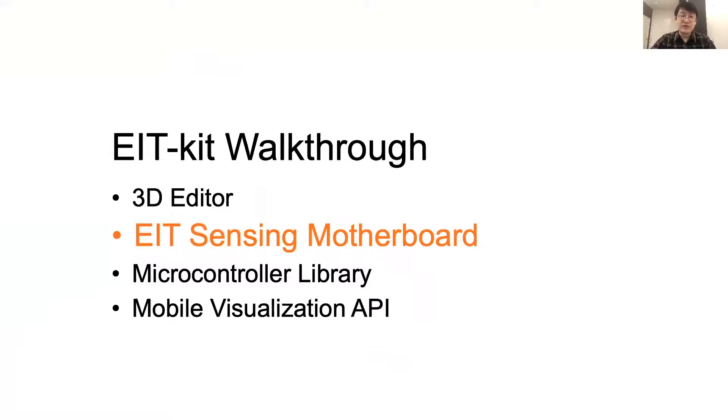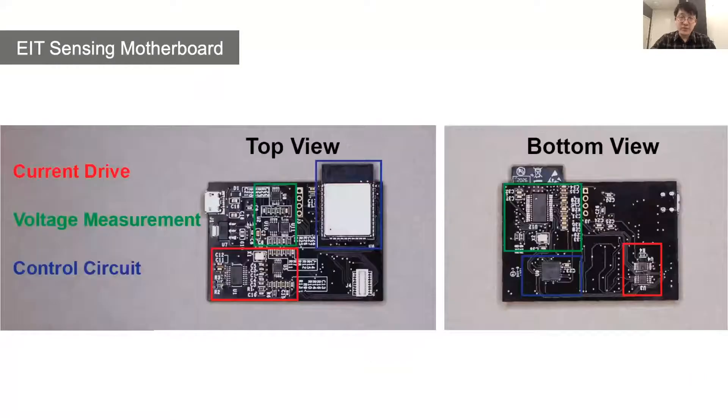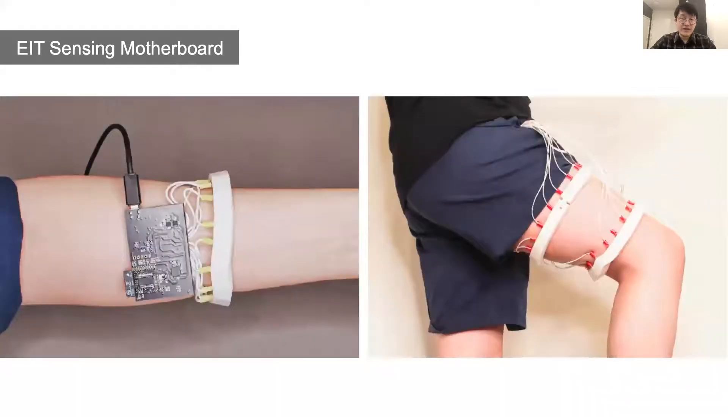The EIT sensing motherboard automates the EIT signal calibration and measurements for different electrode configurations. On the main board, it contains a current drive circuit, a voltage measurement circuit, and a control circuit. Both the differential current source and differential voltage measurement are modulated by digital rheostats, so users have full control over the EIT sensing-related electrode signal parameters. The main board can be flexibly extended to a stack of modular MUX boards, supporting up to 64 electrodes and up to 4 electrode arrays simultaneously.